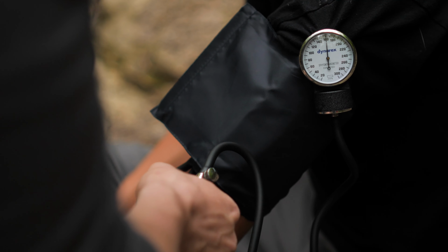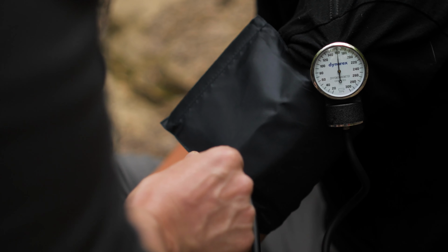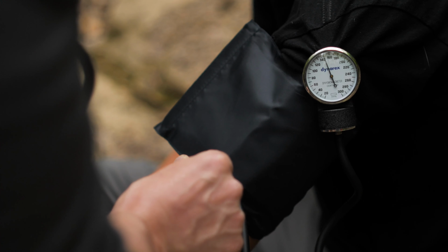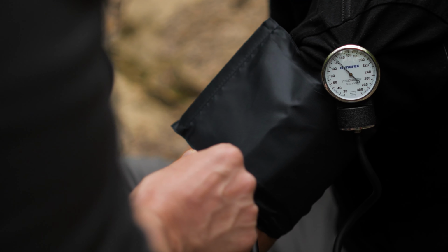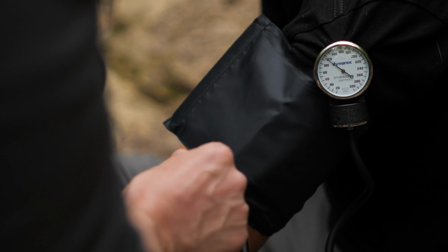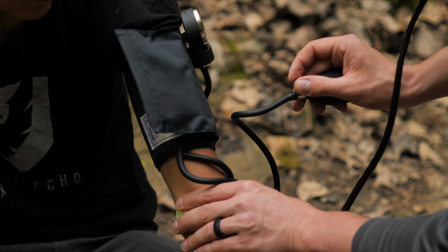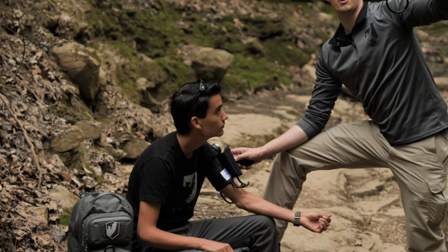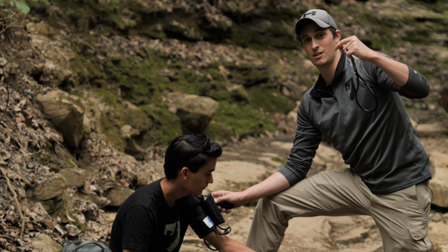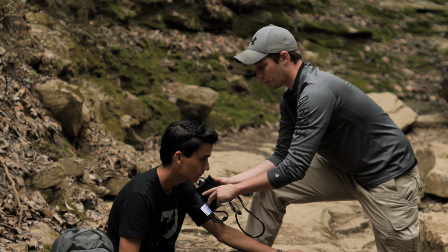Now I'm going to slowly back off on this dial. As it backs off, I'm going to listen for that top pressure. As soon as I hear the heartbeat, I'm going to go ahead and note that. And then I'm going to continue to listen to the heartbeat and continue to let pressure off. And then as soon as I stop hearing it, I'm going to note that pressure. That gives me my top pressure and my bottom pressure, which is my systolic and my diastolic. Once I have those two pressures, I put that together to form my blood pressure.